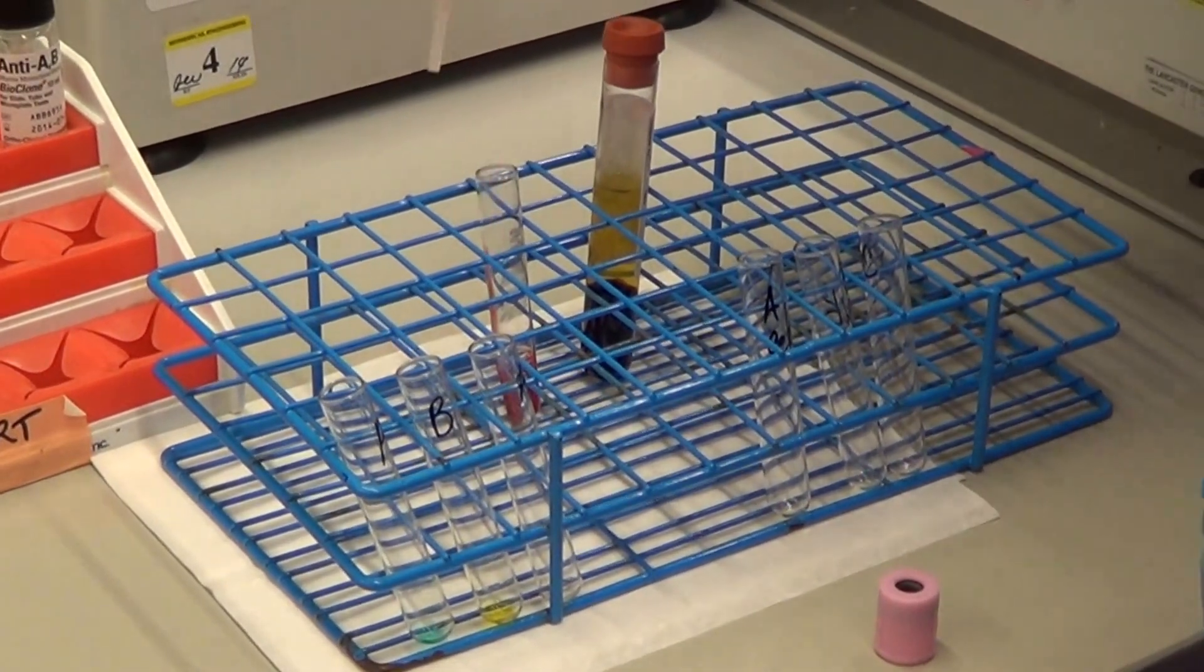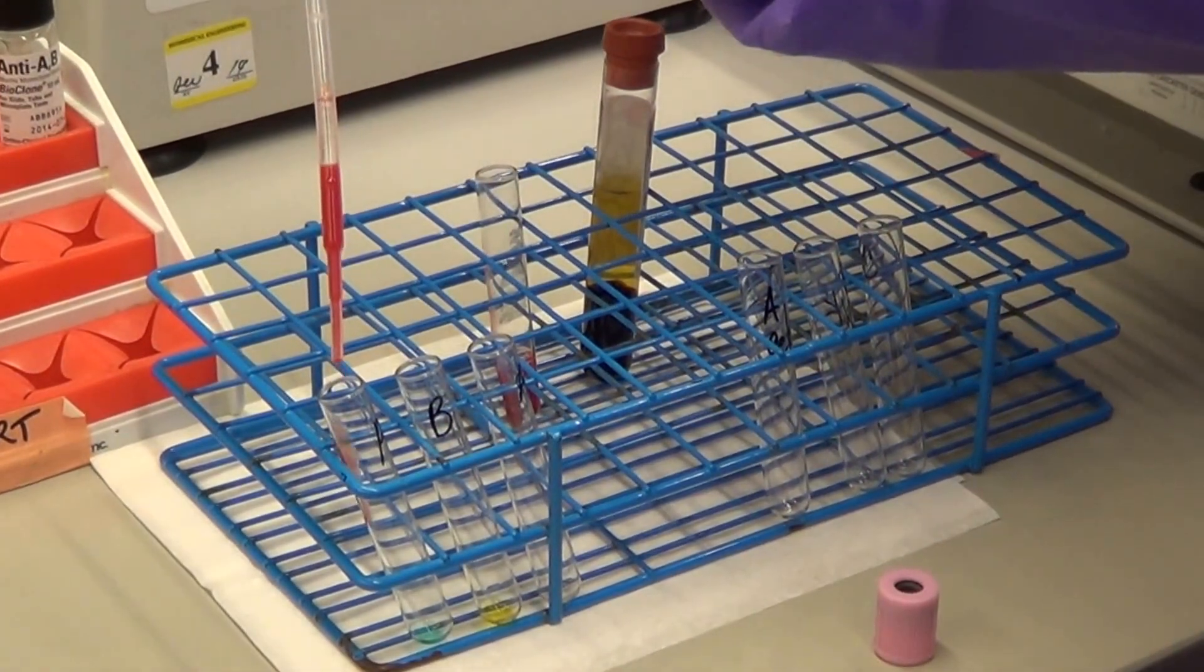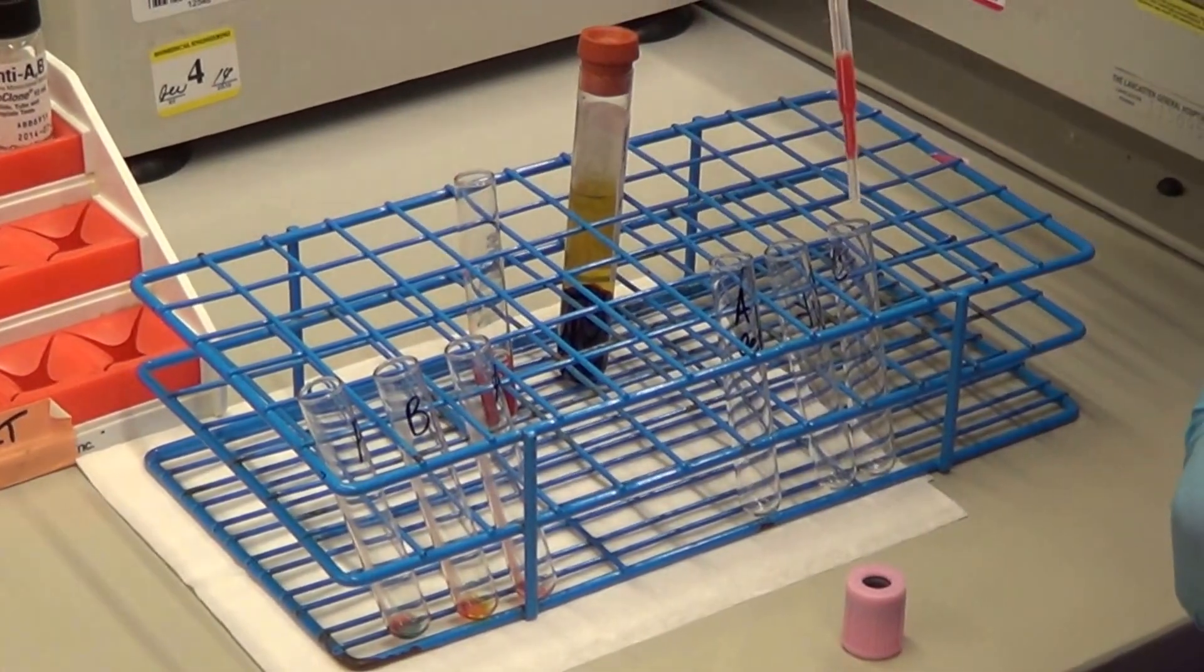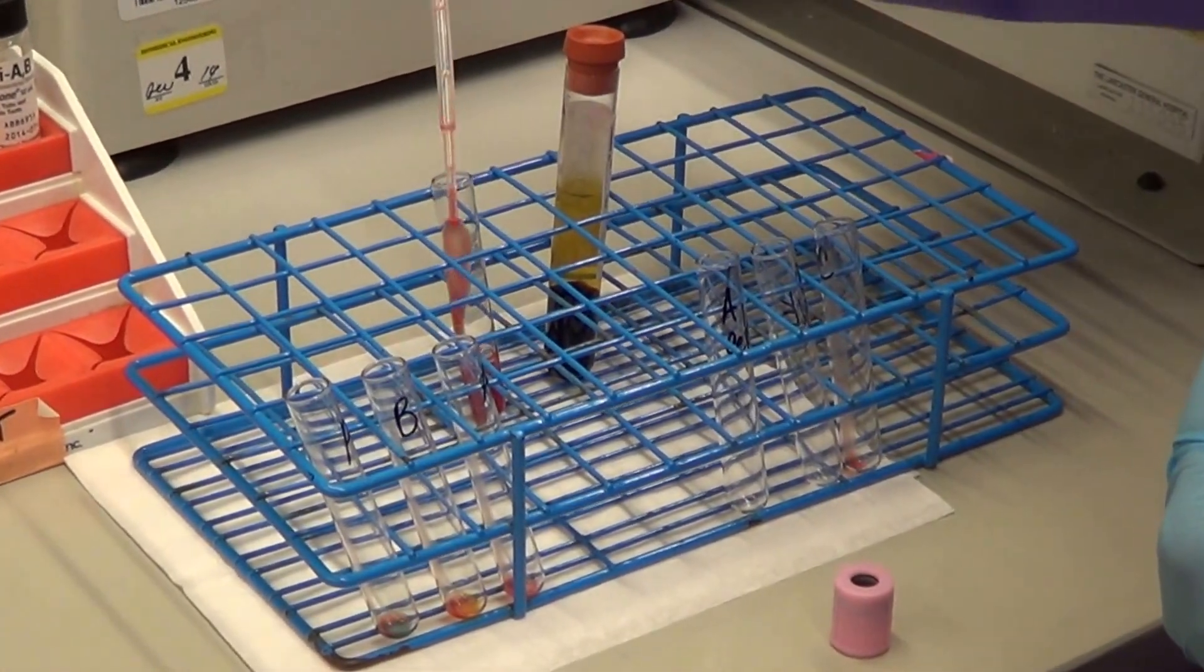Once that is made, you add one drop of the cell suspension to the reagents in the test tubes, and you add one drop to your auto control.